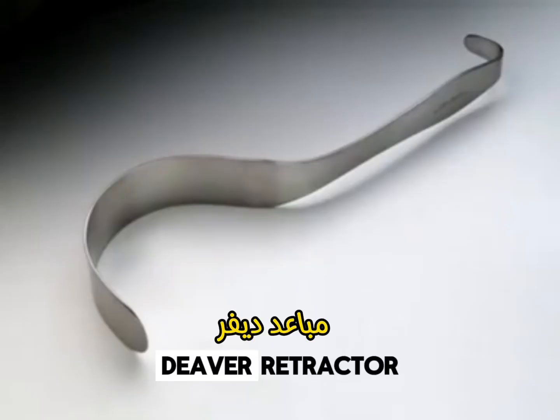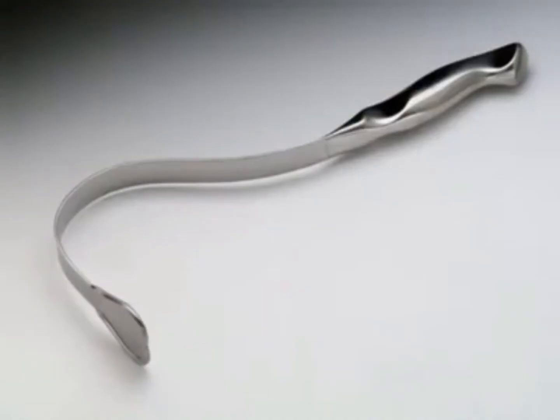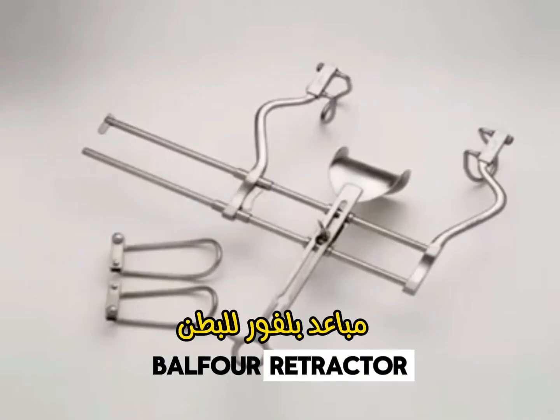Deaver Retractor. Harrington Retractor. Mayo Abdominal Retractor. Balfour Retractor.